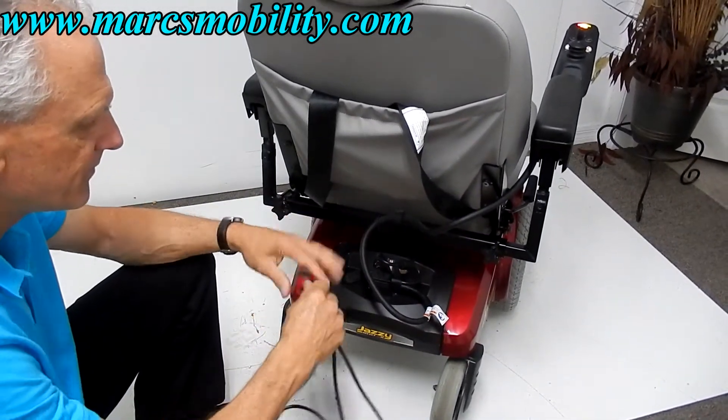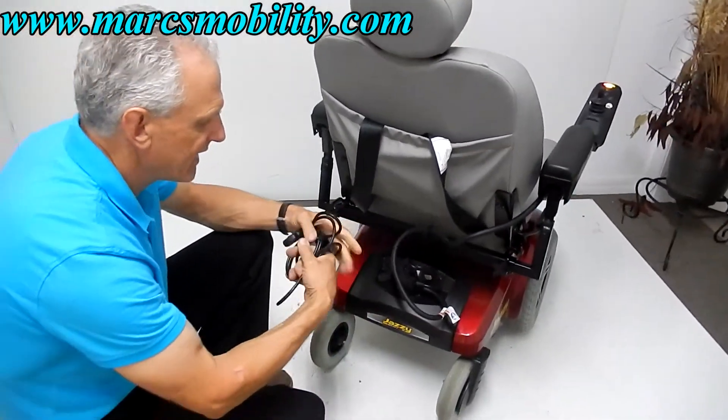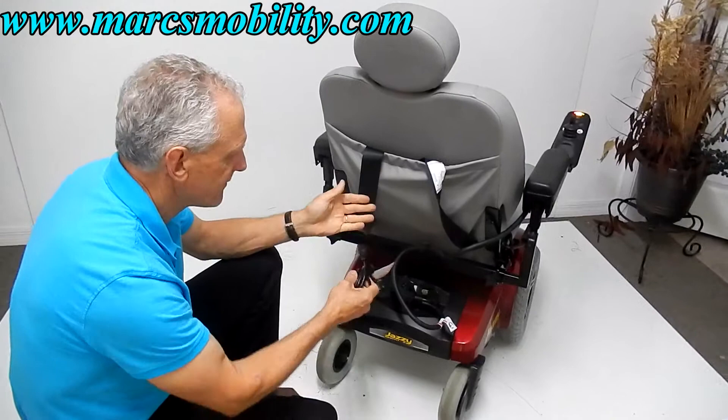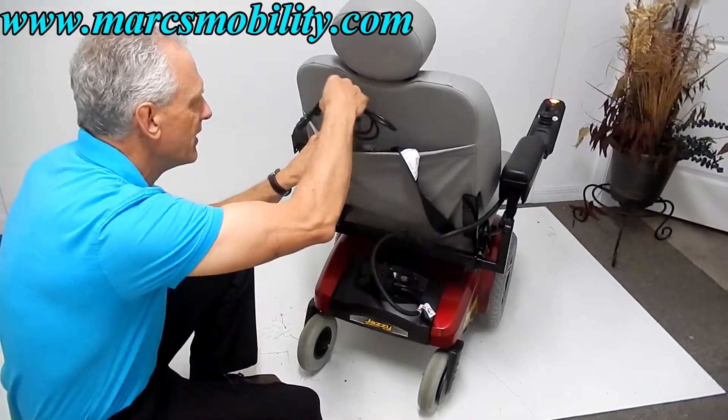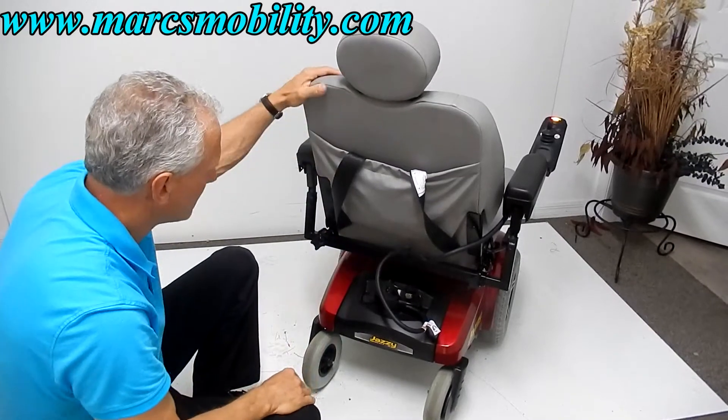The nice thing about these chairs is if you're out somewhere — at Disney World or out shopping — and your batteries get low, you can plug this in for an hour and get another three or four hours of driving time. Very nice.